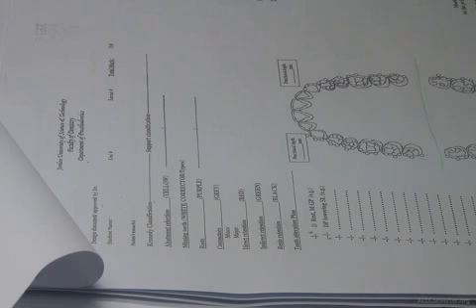Although it's bounded, when it is more than 4 teeth, it shifts the way the metal behaves under force because of some inherent flexibility in the metal itself. This inherent flexibility will make it press on the tissue in the way a free-end saddle does. So there will be minor movement for long bounded saddles.